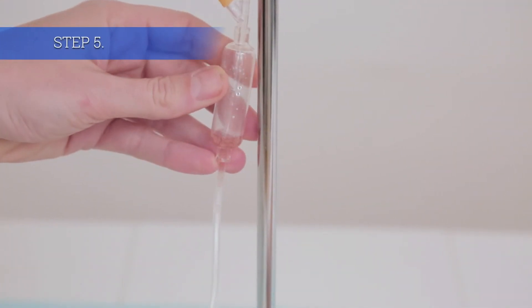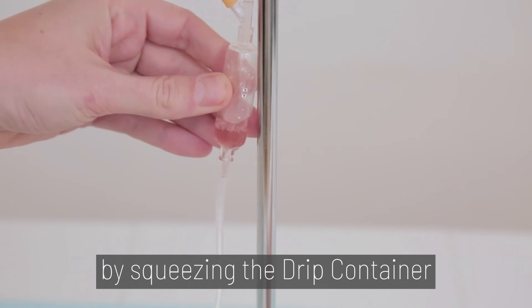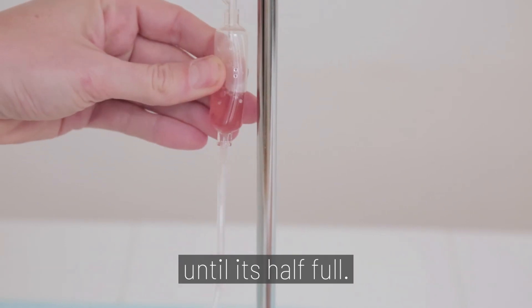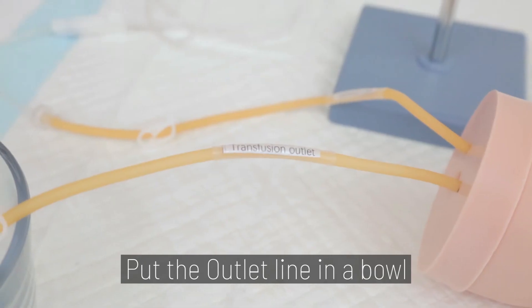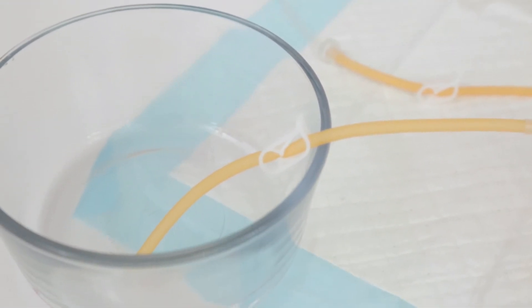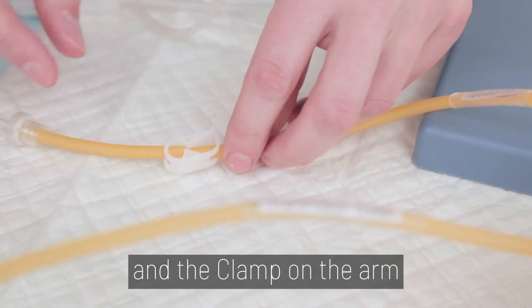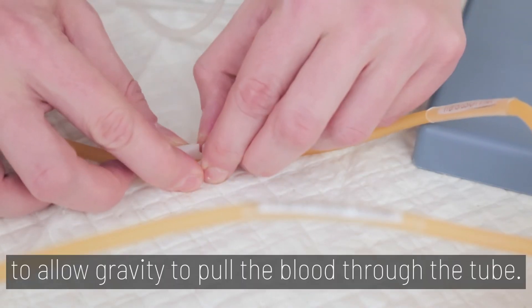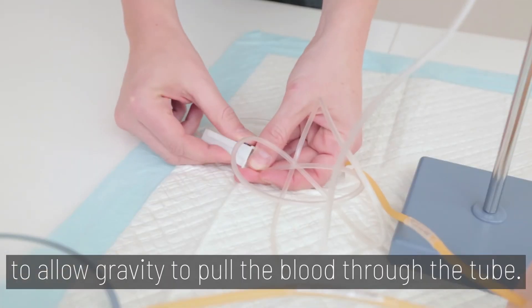Step 5. Prime your infusion line by squeezing the drip container until it's half full. Put the outlet line in a bowl to catch any spills. Release the roller clamp and the clamp on the arm to allow gravity to pull the blood through the tube.